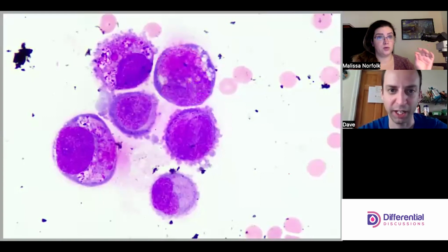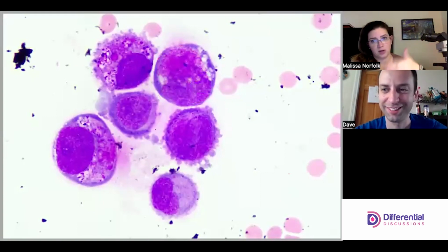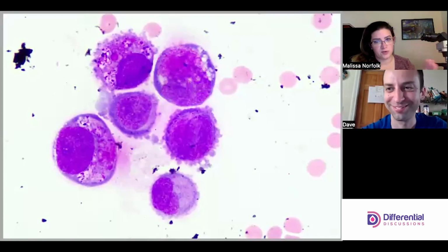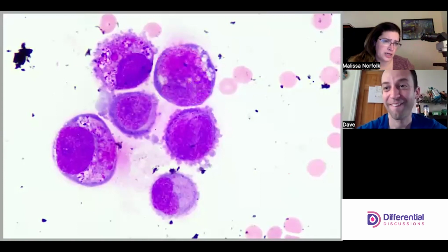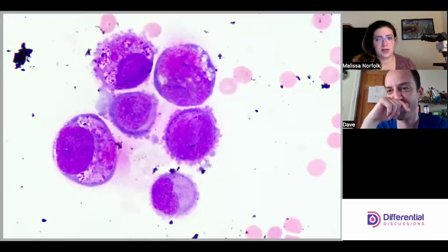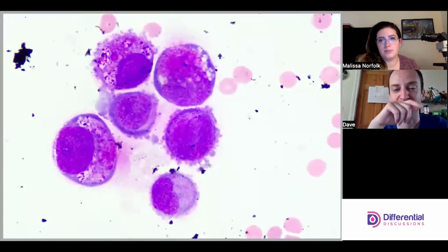Yes, absolutely. When we say basophilia, we're talking about that dark blueness in the cytoplasm. Because I know sometimes people confuse basophilia with basophilic granules, or what do you mean by basophilia? We mean the dark blueness in the cytoplasm. Thank you for stepping in. I jumped around a little bit there, but yes, 100% what Melissa said.